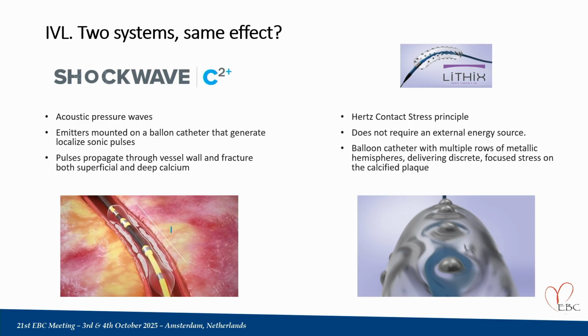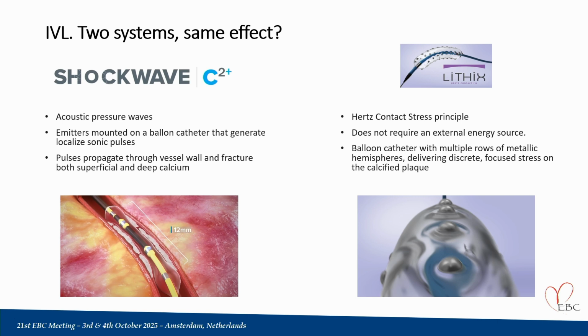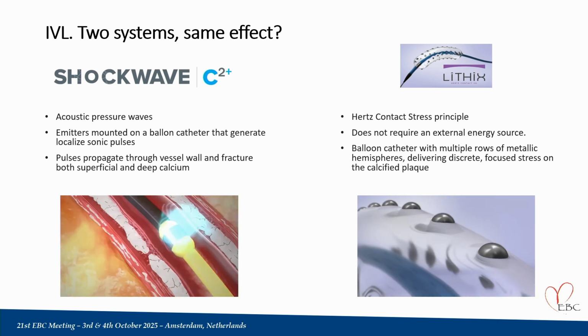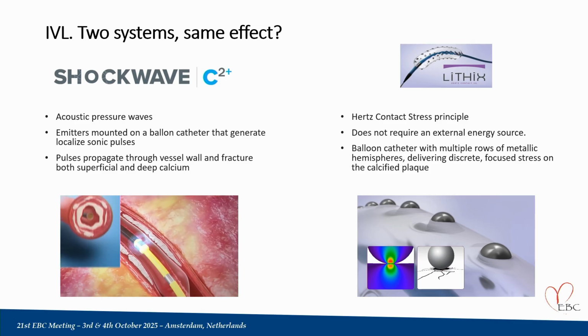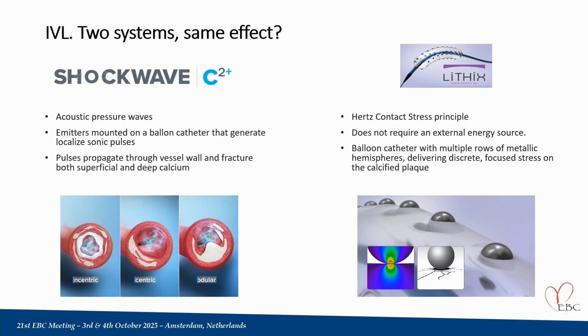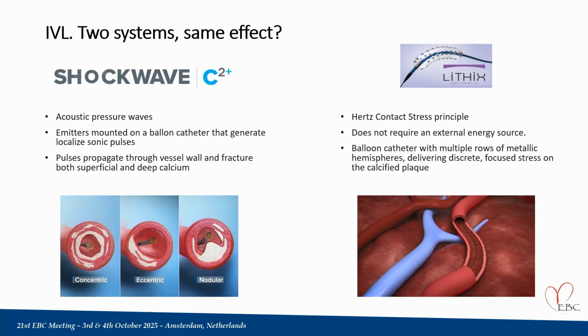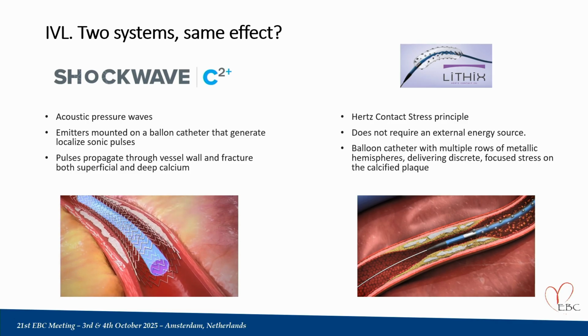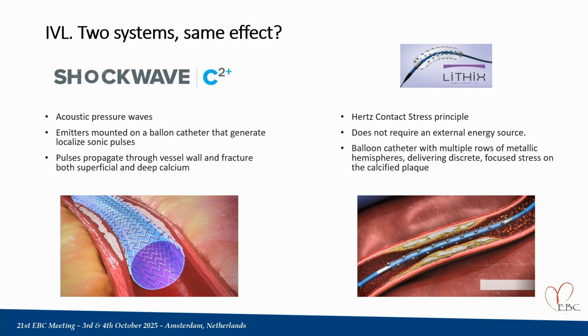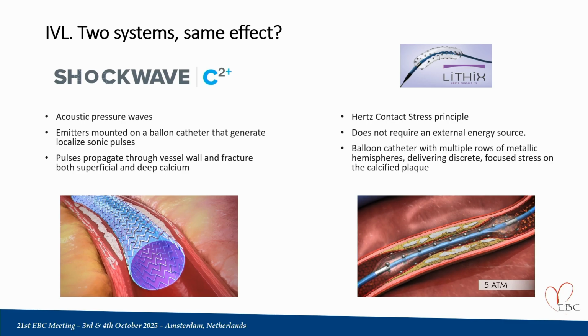It doesn't require an external energy source, and by applying pressure on the balloon, the forces are focused on these spheres, which are able to crack the calcium, right? So generalizing the effect of one technology to the other is still debatable. The data that we have now is mostly based on the Shockwave system, so we need more evidence to really conclude that both systems are equally effective.